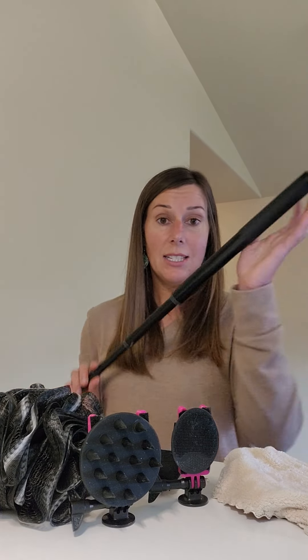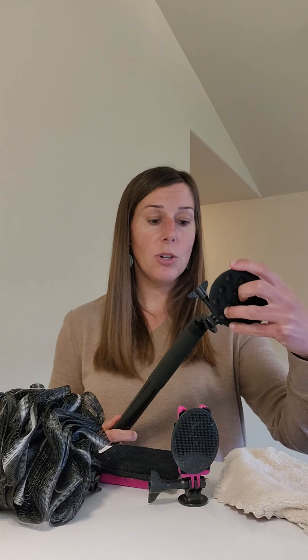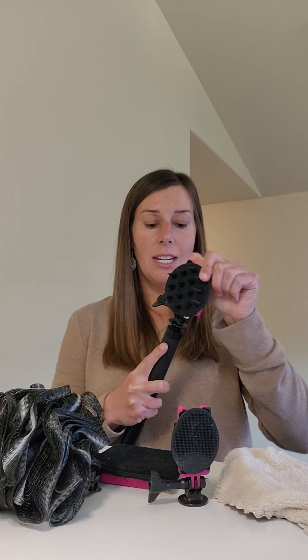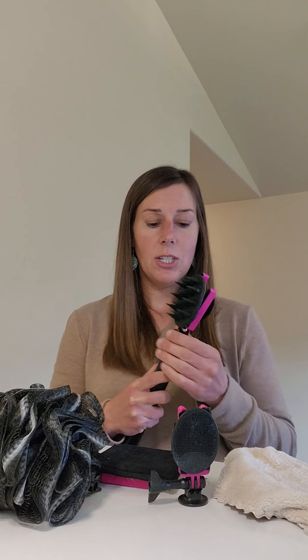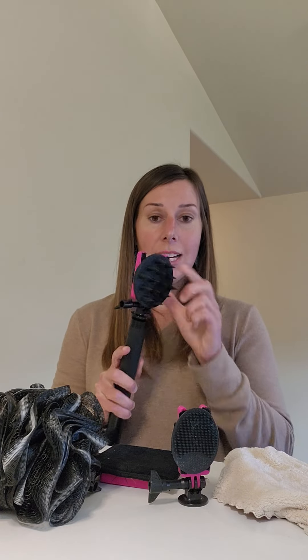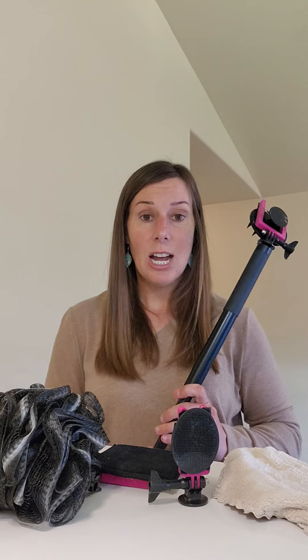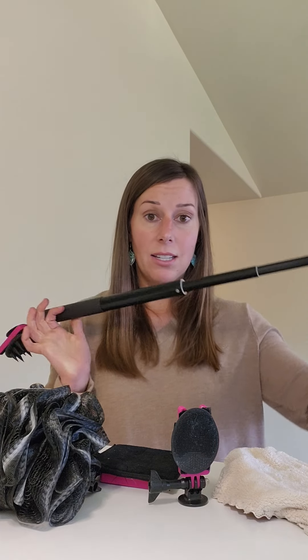The nice part is the dual attachment here, so I can go ahead and put a different scrubber on the other end if I like. I'm just tightening it on, making sure it's nice and tight, getting it at the angle that I want, tightening it up, and then I am ready to go and shower in a way that I can reach everywhere I need to.